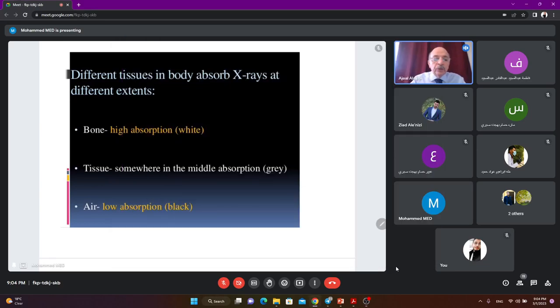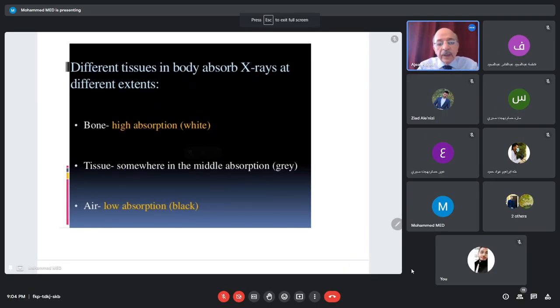I'm going to talk to you about X-ray of the lungs and X-ray of the heart. This lecture is intended for medical students and practicing junior doctors. I will try to make things very easy for you because I believe the chest X-ray is a very important investigation, and as I said in the previous lecture, it's usually available to you whenever you get a patient in casualty as an emergency case.